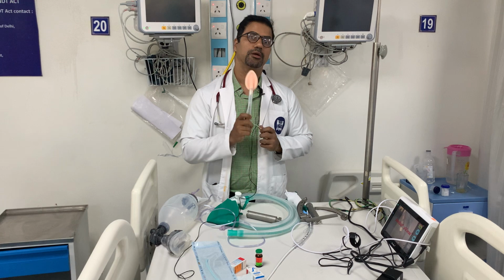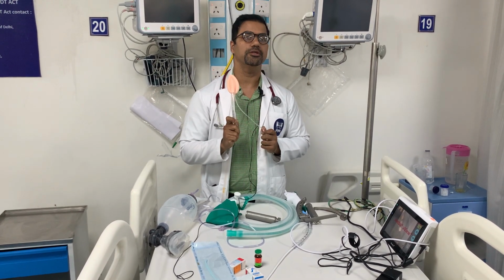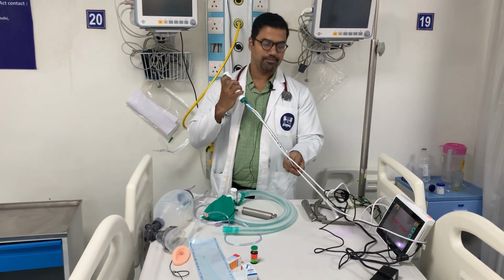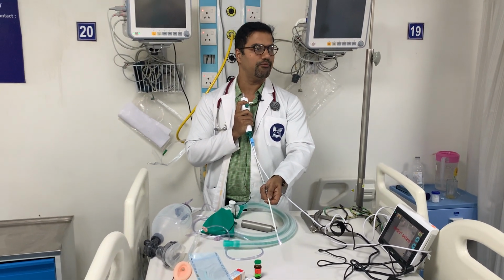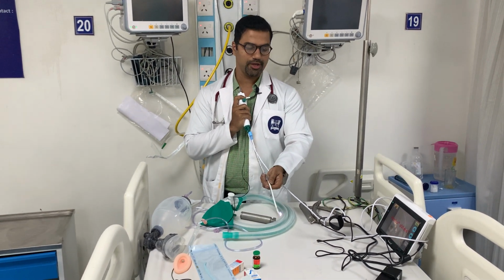Fine. Okay. Supposedly you have tried this. Again you failed. Is there any other option that you can save the patient? Yes, we do have. We can use this. In most of the ICUs nowadays, this is available. This is called the ambuscope. If you have a backup for fiber optic laryngoscope, fair and well. If you don't have the backup, you can use the ambuscope. It's as good as a fiber optic laryngoscope.